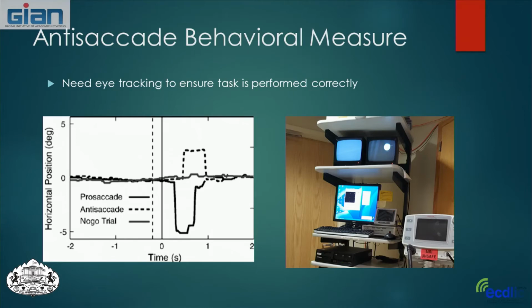And this is what our eye equipment looks like in the control room. You see this monitor here is labeled MR Unsafe. Things around the MR environment are labeled MR Safe or MR Unsafe. And this is the computer that we use. And we have this projector, like I mentioned, in the control room.